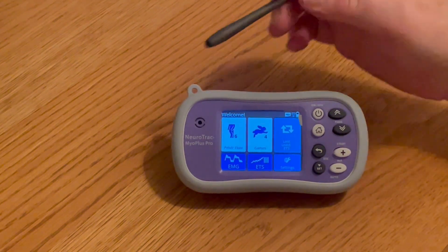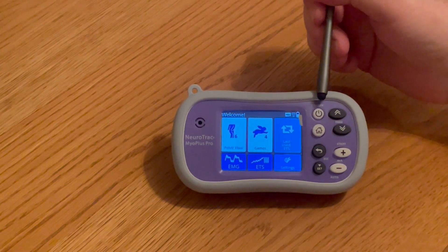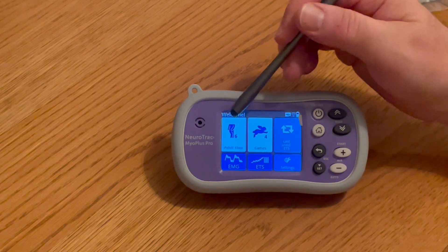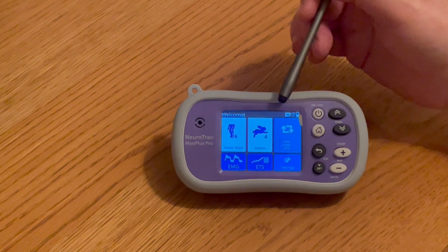Let's look at this Neurotrack MyoPlus Pro. This is a single channel EMG and a single channel stimulator. It can be used EMG only, stimulation only, or ETS which is basically EMG triggered stimulation.